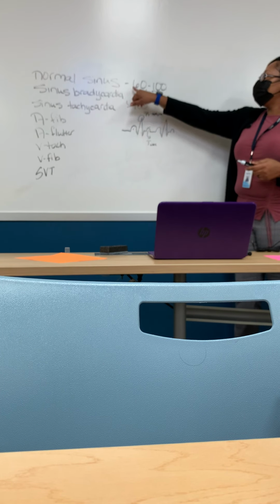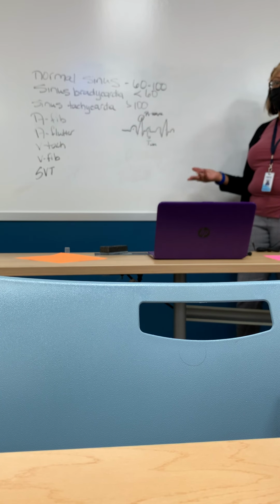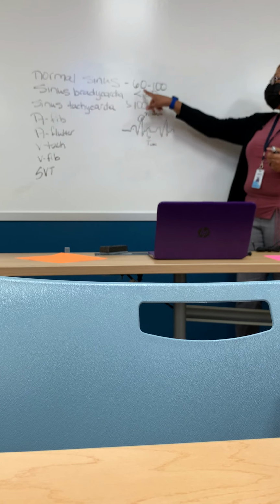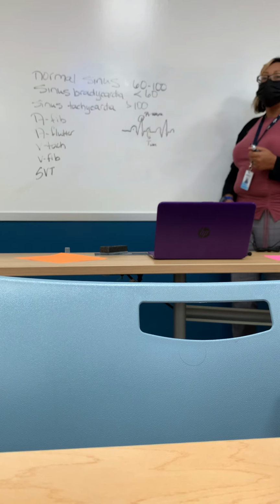So which one of these rhythms is that? It's a normal sinus rhythm. Right? One is 80, one is 60. If it is between 60 and 100, you're in normal sinus. Okay?